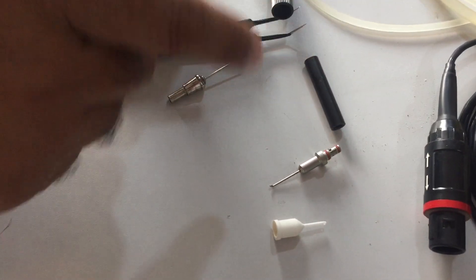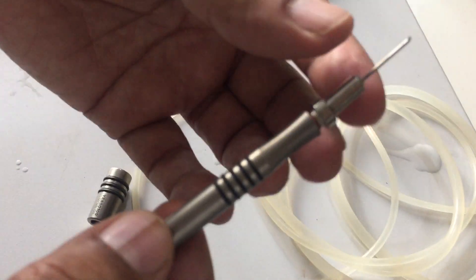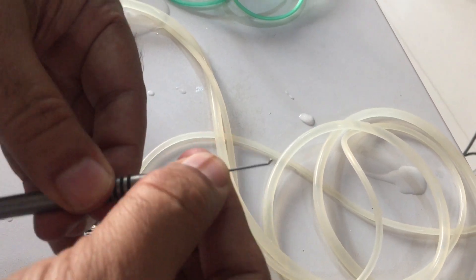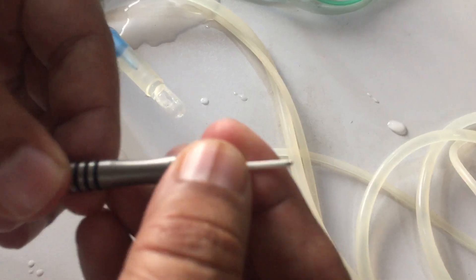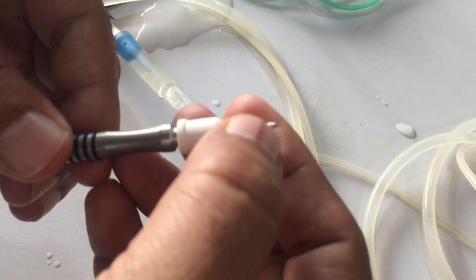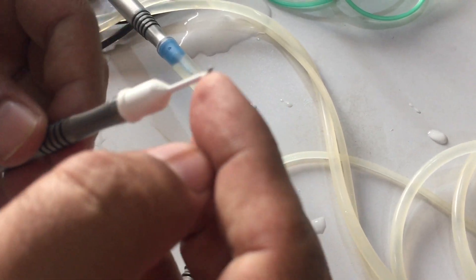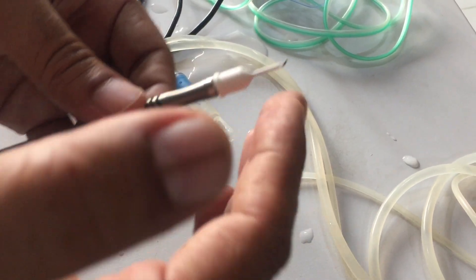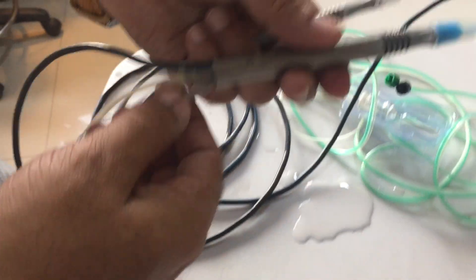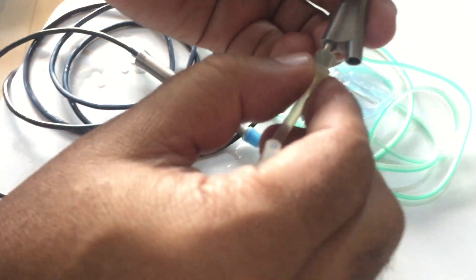The second step is I&A. After removal of the nucleus, you will remove the cortex using the coaxial I&A handpiece. Here is the tip — you mount the tip by just pressing it. Then you mount the sleeve on the I&A handpiece. Be careful that the tip should come from the center of the sleeve, not on the side.